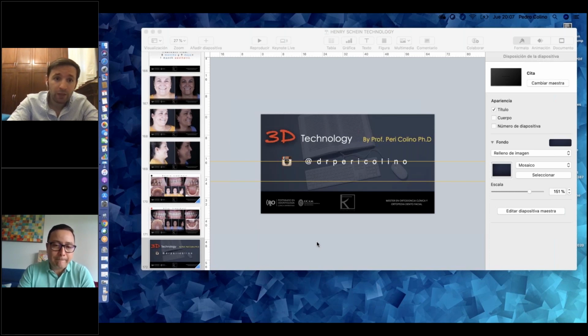In class 2 patient, I change 3 times a day the elastics from the beginning, okay? And I use force 1 the first month in class 2, and after the first month, force 2. Force 1 is 1/4 inch and 6.5 ounces. How do you say inch? Or thumbs. How do you call the inch? Okay, sorry, I repeat. The first month I use force 1 in order to correct the class 2.